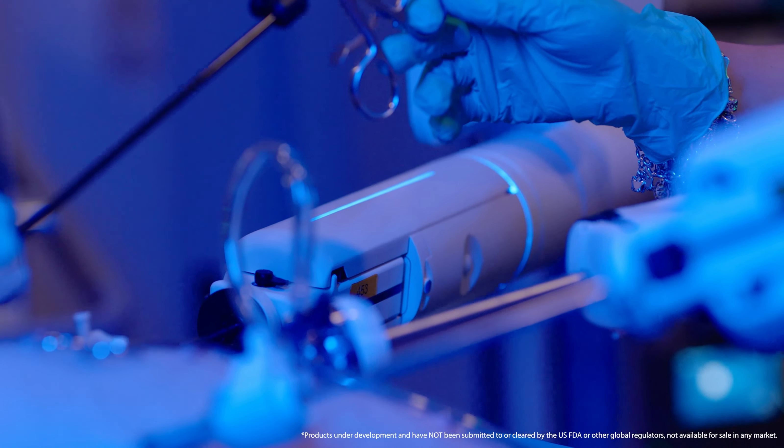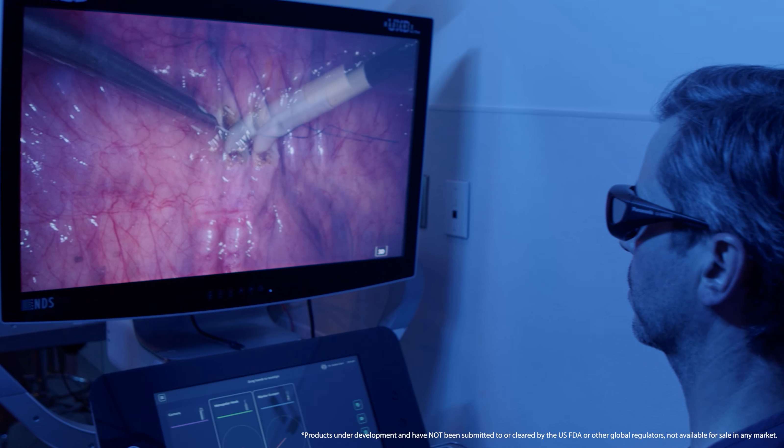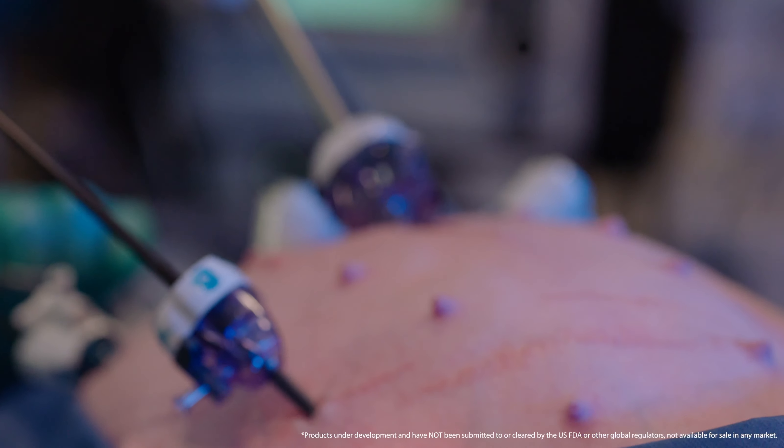Seeing this early version of LUNA, I'm pretty excited for what's to come. The ease of use, the simplicity of instrument exchange, the information that the arms give to the operating room team in real time — that information is reflected to the surgeon on the console. That's all going to elevate the robotic surgery experience to a level that most surgeons have not seen yet. I'm also looking forward to the ISU capabilities, because those really represent the next wave of surgery — the addition of artificial intelligence and how we work with surgeons to make surgery safer. That is what I look forward to most.